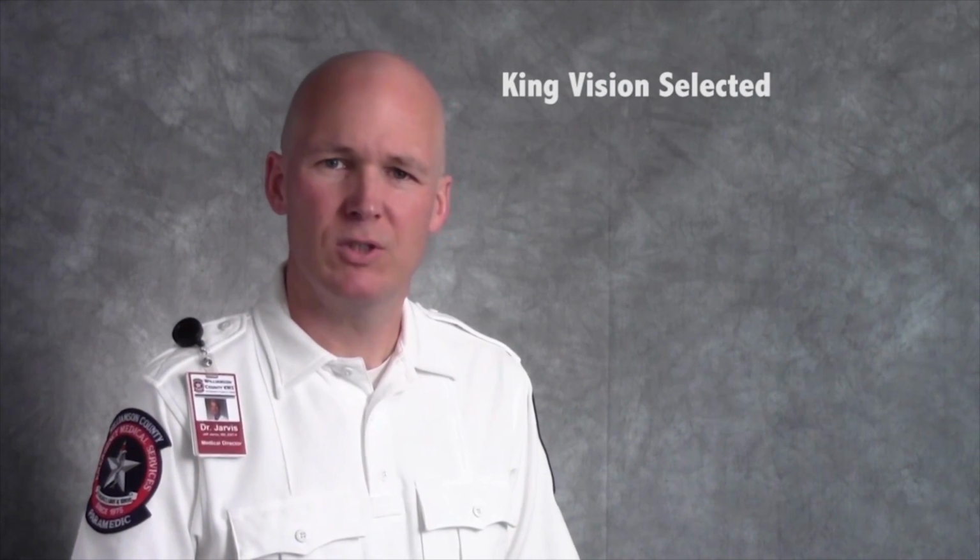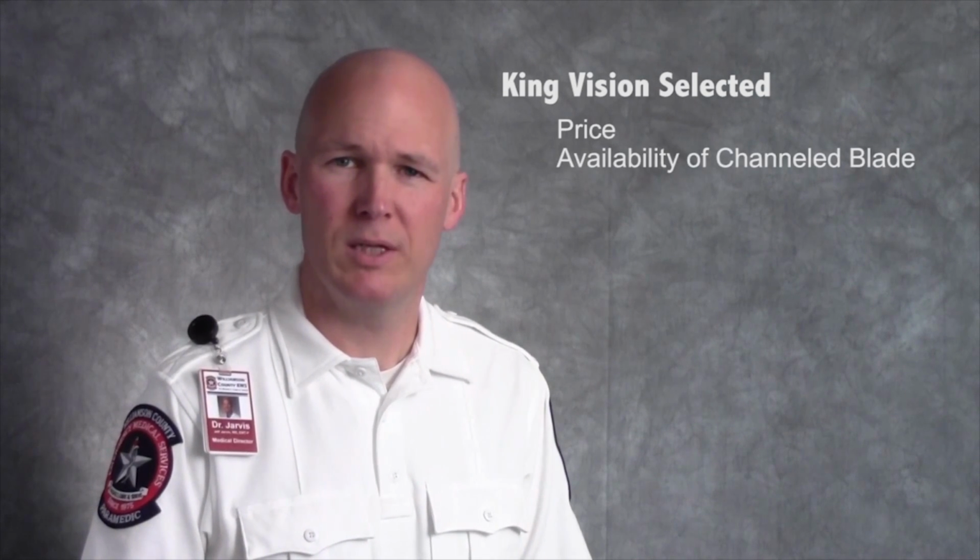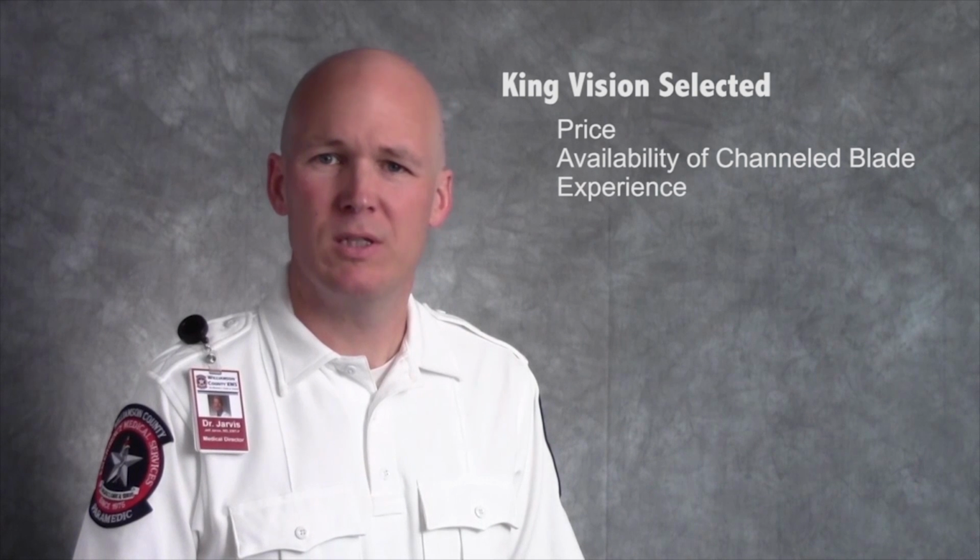We selected the King Vision laryngoscope based on its price, the availability of a channeled blade, and our experience with it during our mannequin, cadaver, and field trials. We also did an analysis of each intubation attempt with the King Vision during these trials. We used the information from this analysis to refine the method we use to teach our paramedics how to use the device. We've been using it now for about a year and a half and have seen a marked improvement in our intubation success.